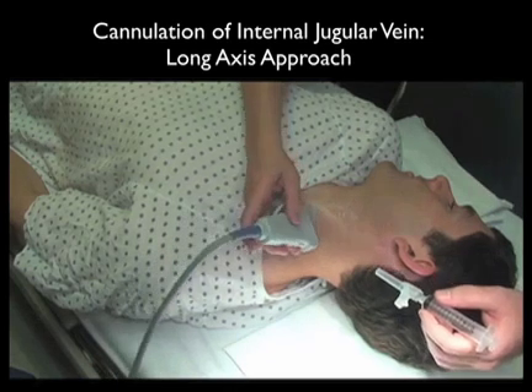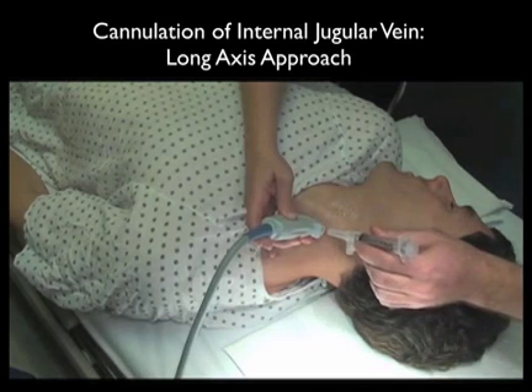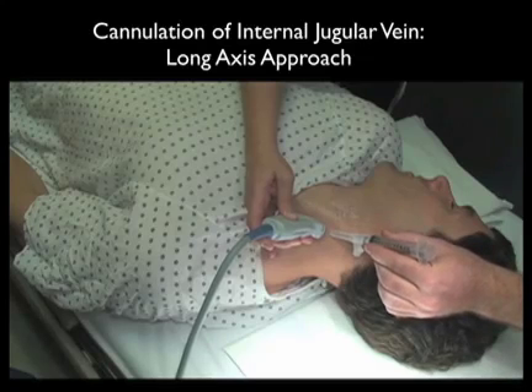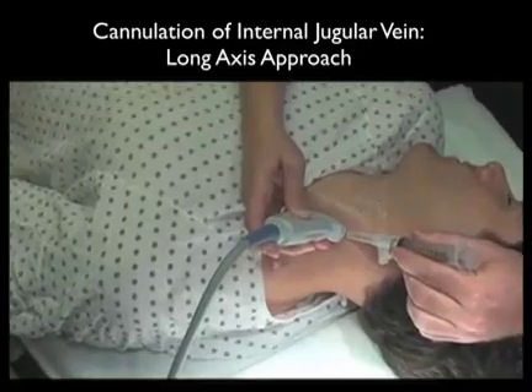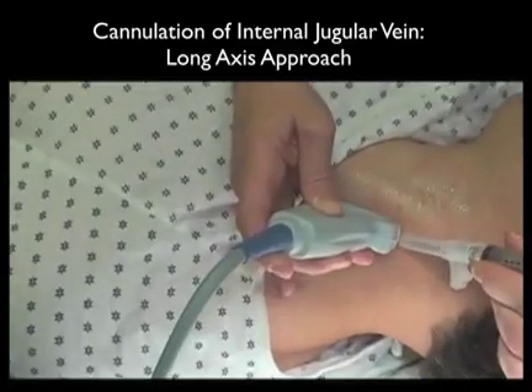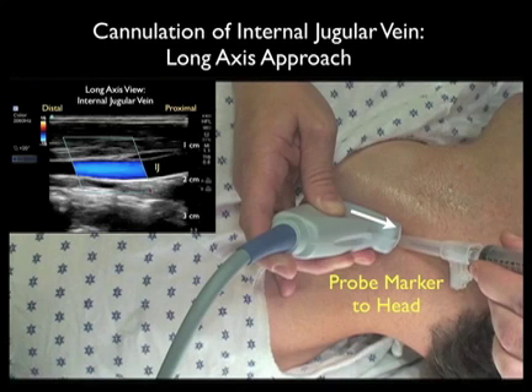This video sequence shows cannulation of the internal jugular vein using the long axis trajectory. Notice we swivel the probe into the long axis orientation along the course of the internal jugular vein as it runs up and down the patient's neck. By convention, the probe marker should be oriented distally or towards us as we stand at the head of the bed. The cannulating needle will come in at a 45 degree angle under the distal aspect of the probe, so we look towards the left of the screen for the cannulating needle coming down to the vessel.